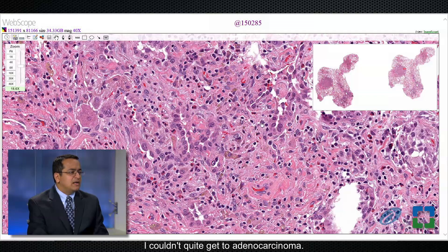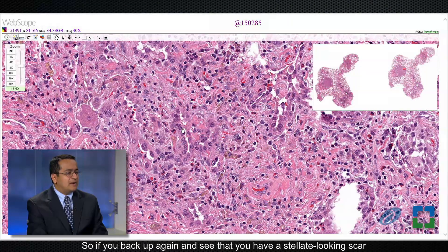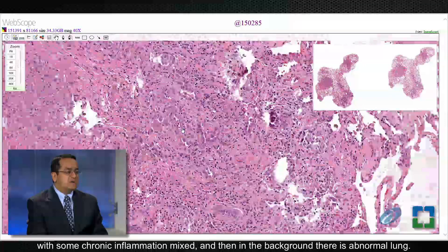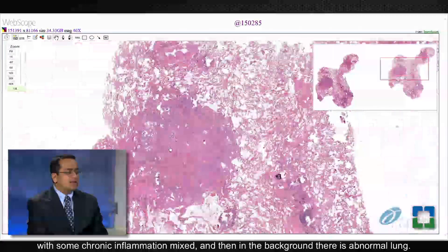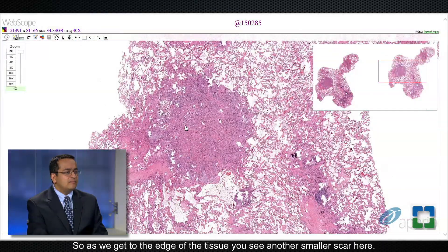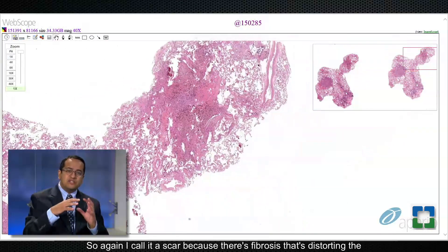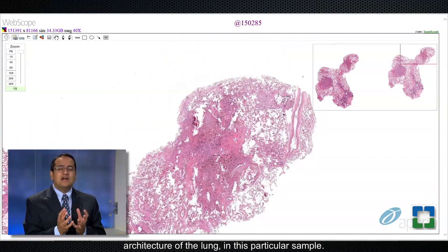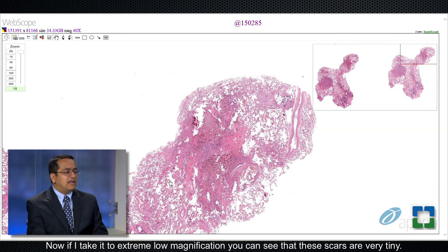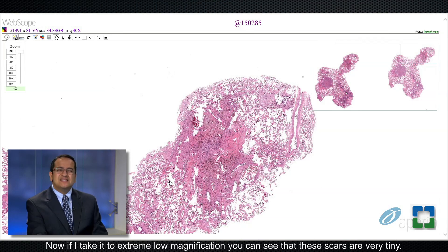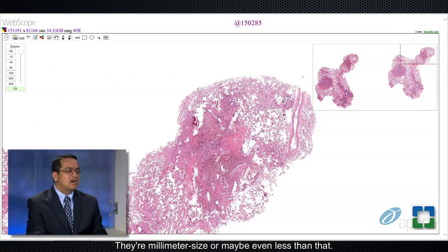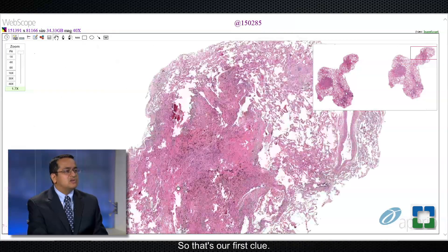I couldn't quite get to adenocarcinoma, and in fact the background of the lung suggested a different diagnosis. If you back up again, you see a stellate-looking scar with some chronic inflammation mixed in, and then in the background there is abnormal lung. As we get to the edge of the tissue you see another smaller scar. I call it a scar because there's fibrosis distorting the architecture of the lung in this sample. At extreme low magnification you can see that these scars are very tiny — millimeter size or maybe even less than that. So that's our first clue: a stellate scar.